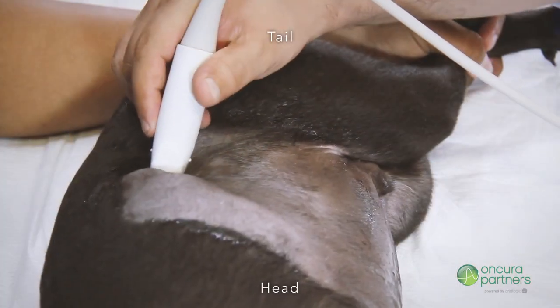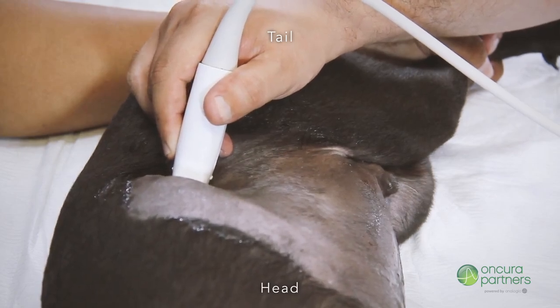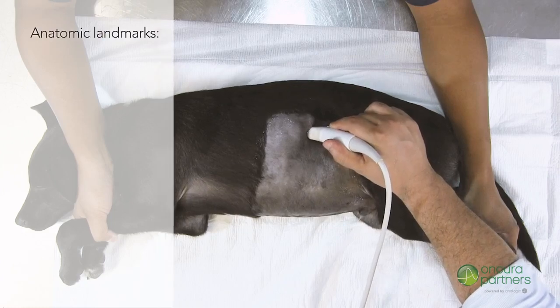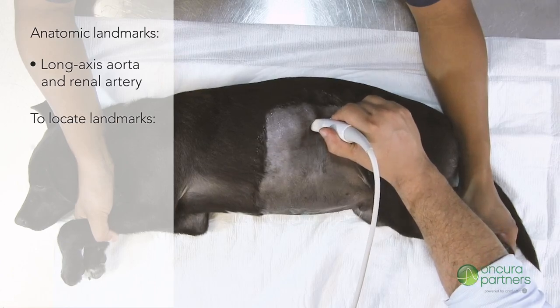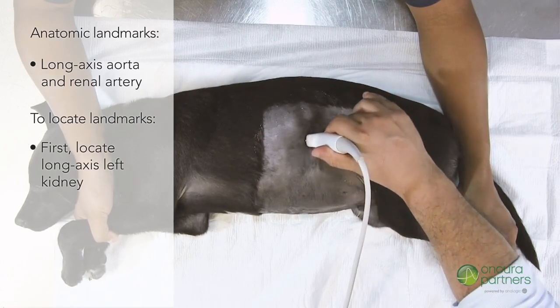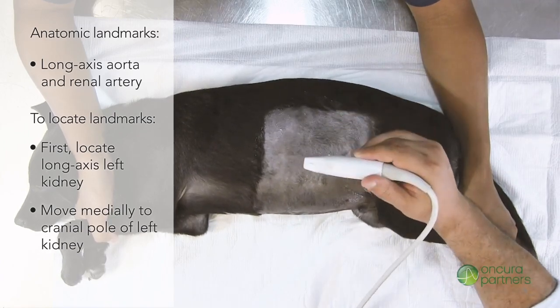Place the transducer in the long axis, caudal to the last rib dorsally, and begin searching for the anatomical landmarks. The first anatomical landmarks are the long axis views of the aorta and renal artery. To locate these landmarks, first locate the long axis view of the left kidney. Then move medially to the cranial pole of the left kidney until the landmarks are visualized.